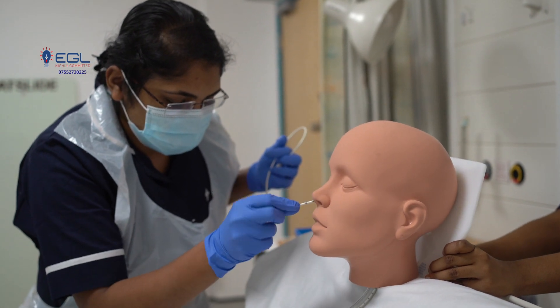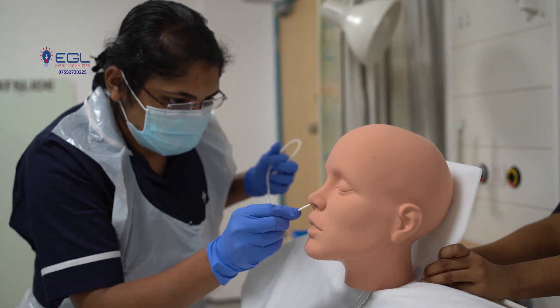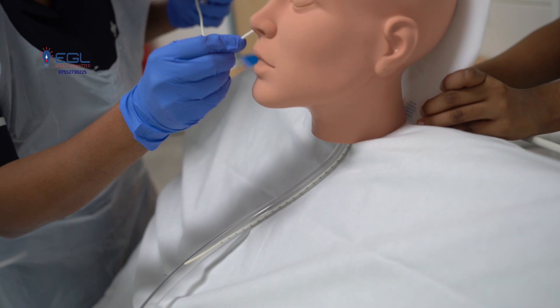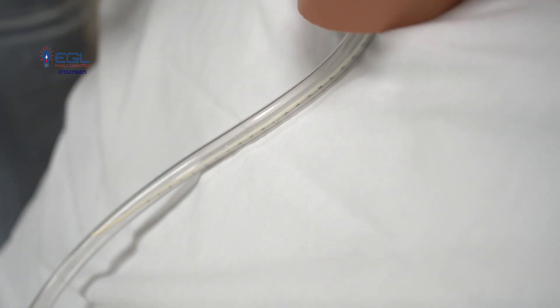You can swallow the tube. I have reached the measured indicator. I am going to fix the tube.